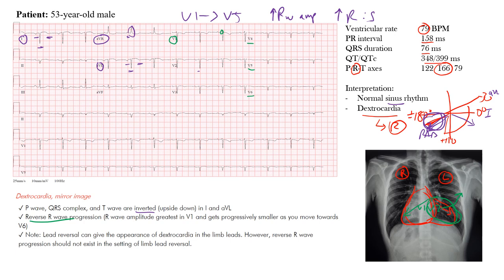What tells dextrocardia apart from limb lead reversal? Both conditions can look similar in the limb leads, but the reverse R wave progression in the precordial leads is not seen with limb lead reversal — because limb lead reversal only affects the limb leads and doesn't touch the precordial leads. If the precordial leads are also messed up, that's a lead placement issue, but that's typically not the case.